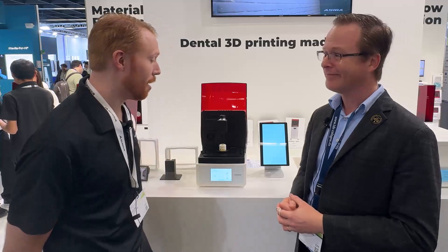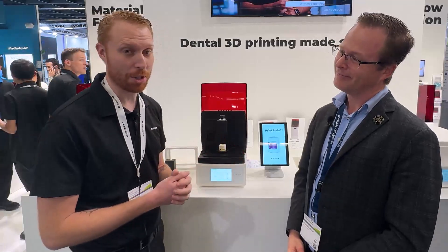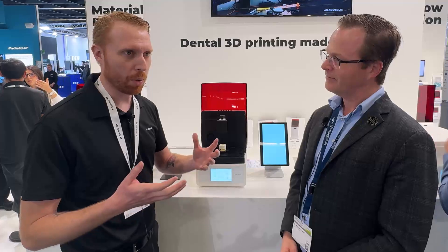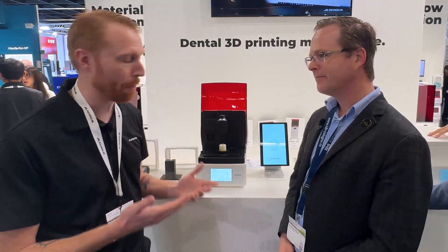Hi everybody. We are absolutely thrilled to announce this amazing new product here at IDS and really excited to have Dr. Michael Scheer here to get one of the first looks. What we really wanted to do was figure out a way to create the ideal all-in-one machine. You see a lot of products that maybe do one thing really well. We really wanted to solve the issue of having a machine that can do it all, and do it all really well. So what we have here is the new Ocega Print Pods.